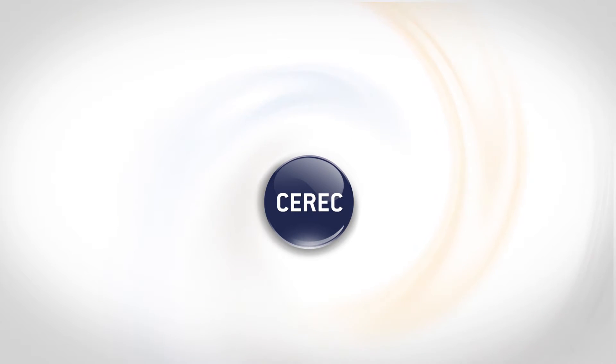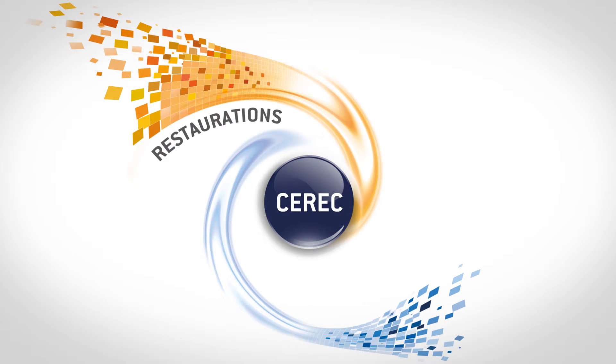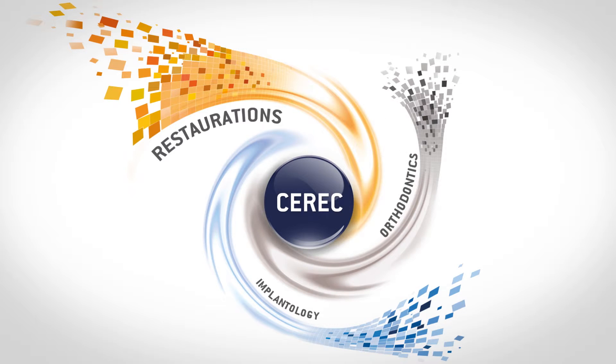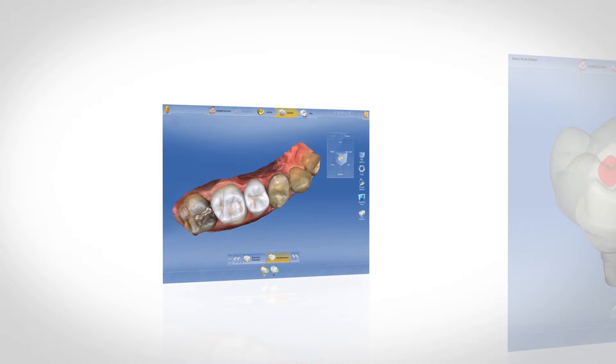Today, CEREC's range of services includes three treatment areas: restorations, implantology, and orthodontics. CEREC makes practices more attractive, more efficient, and more successful. The reasons are obvious.